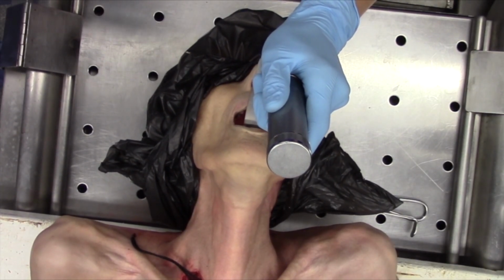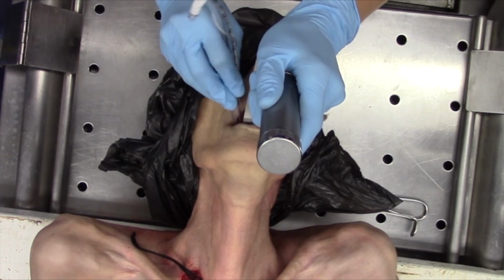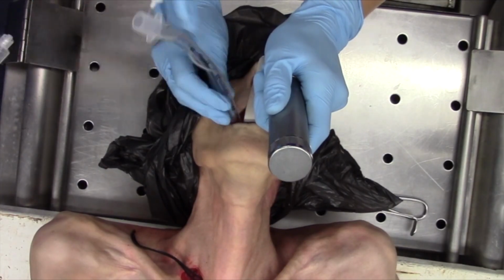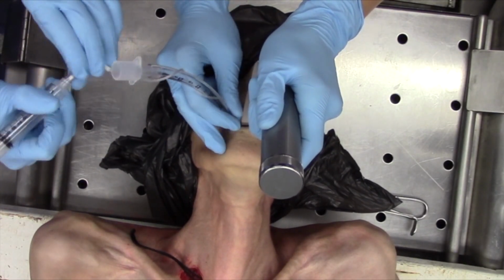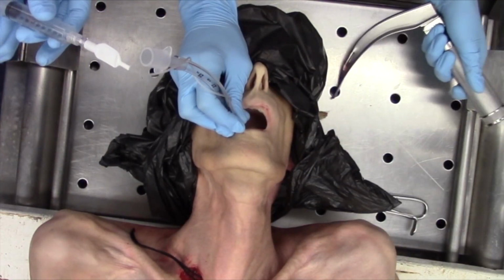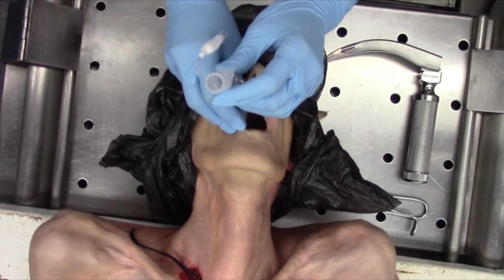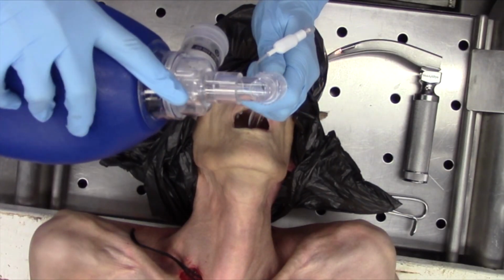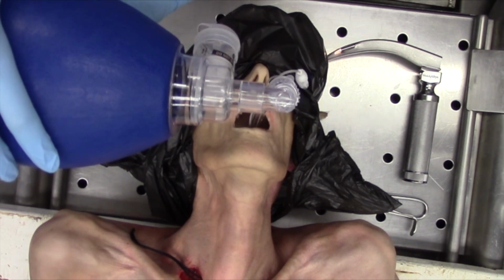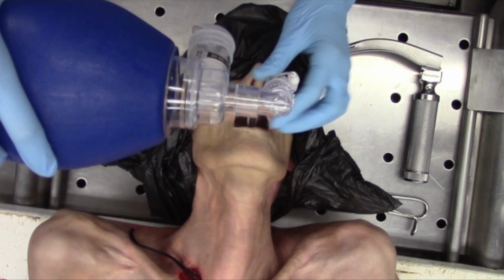Now can I have the tube, please? I advance the tube until the cuff is just beyond. Using the 10 cc syringe, we will inflate the cuff. I'll remove the blade. Okay, and now we'll attach the ambu bag to the ET tube, and then we can check to see if it's in the right position.